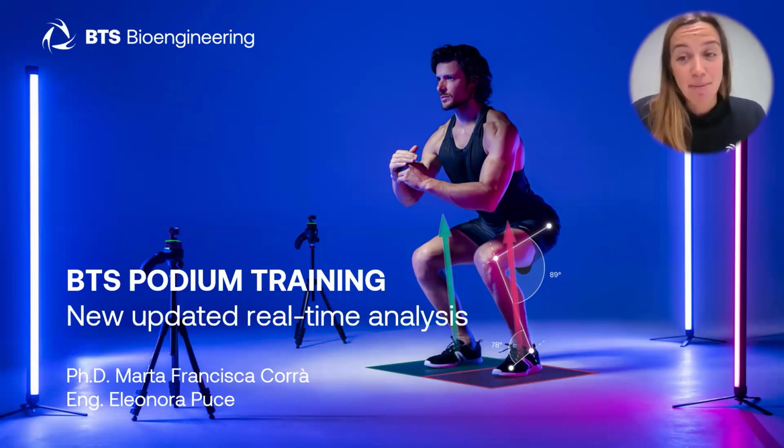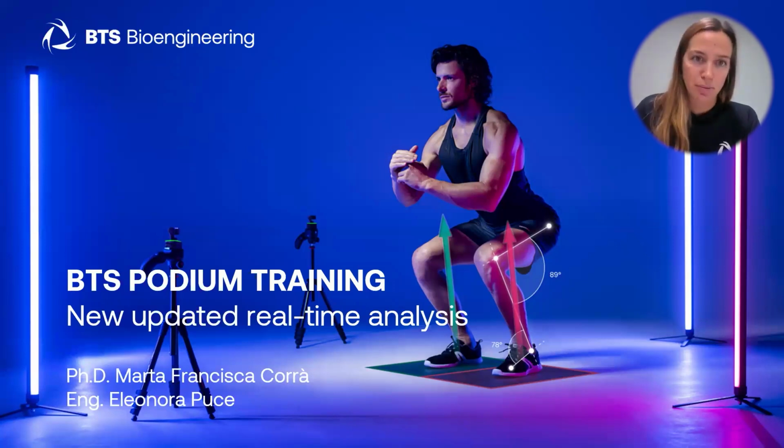So welcome to this webinar. Today we are going to explore the Podium system, which is our new updated real-time analysis system. We will analyze in detail a specific sport gesture, the squat jump protocol, going through the goal of this functional protocol, the test execution, and the interpretation of the report.